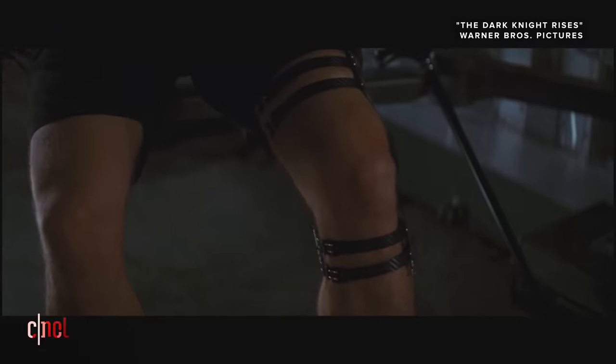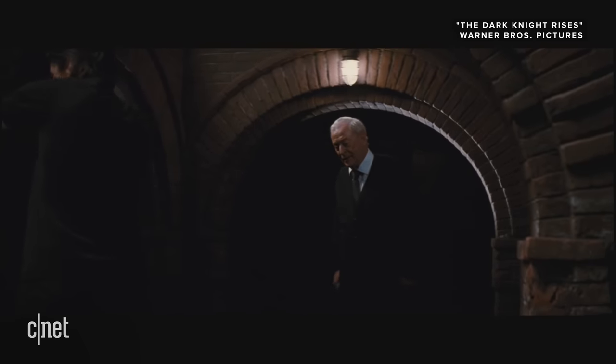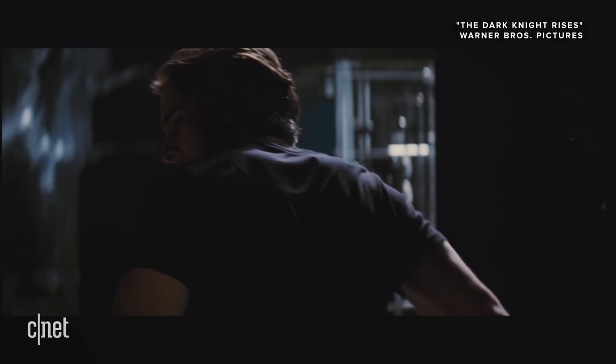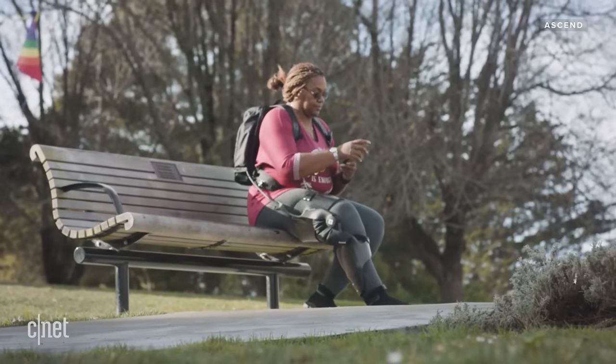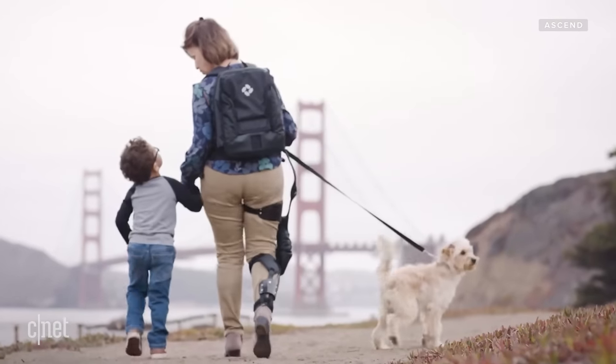Exoskeletons are literally stepping out of superhero movies into the real world. Remember Bruce Wayne's knee brace in The Dark Knight Rises? Well, the Ascend won't help you kick through walls, but this smart orthosis can help people with osteoarthritis and knee injuries regain mobility and relieve pain.